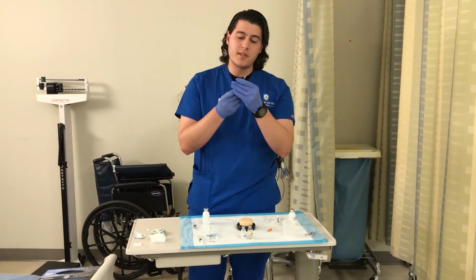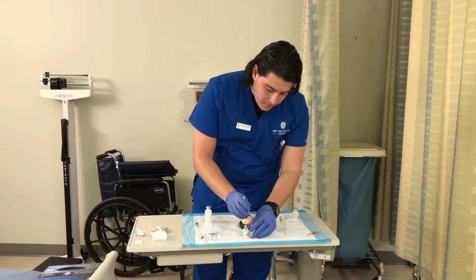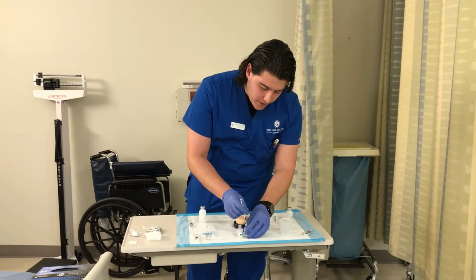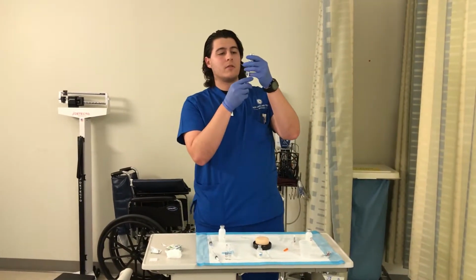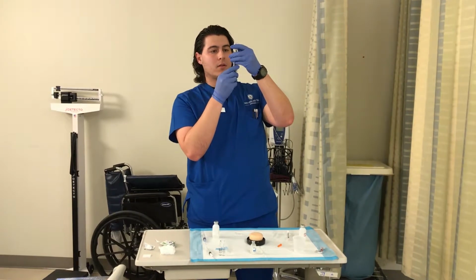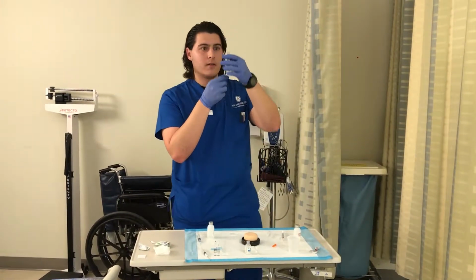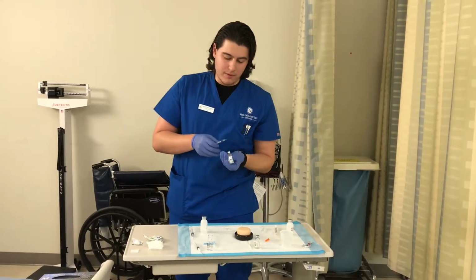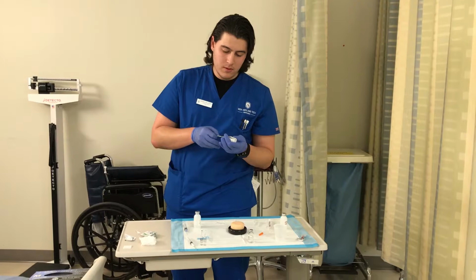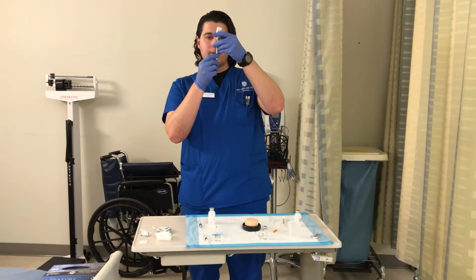With any injection, you're always going to put the air in first. Put the air in. And then we're going to withdraw. Okay. And we're going to withdraw from this one. That'll be another 10.